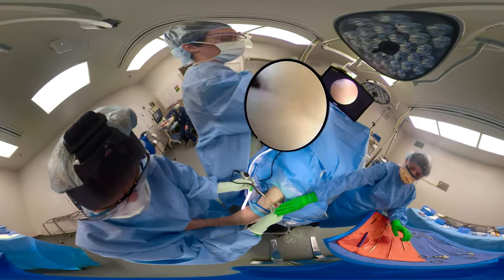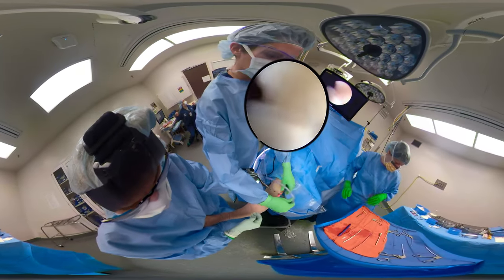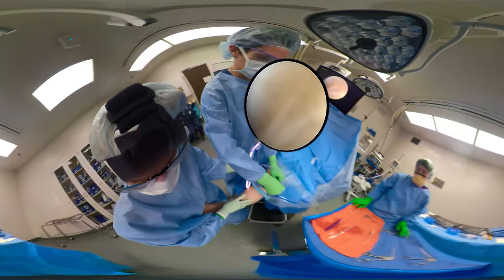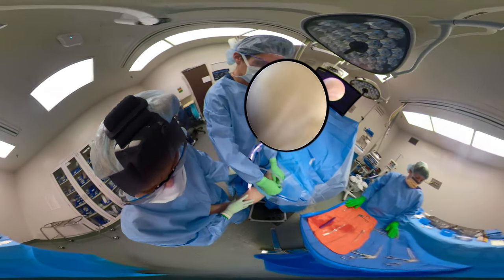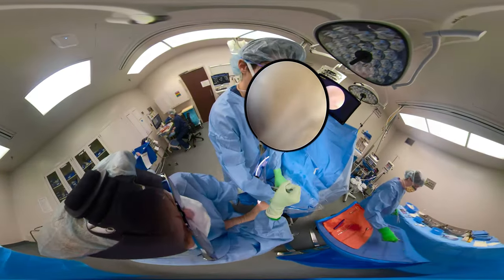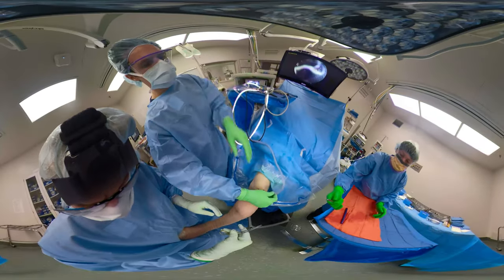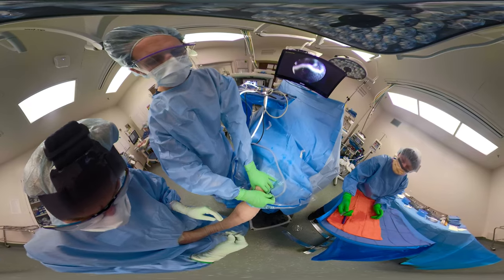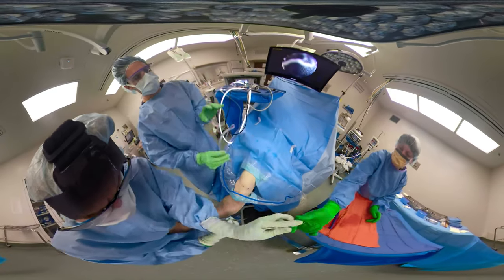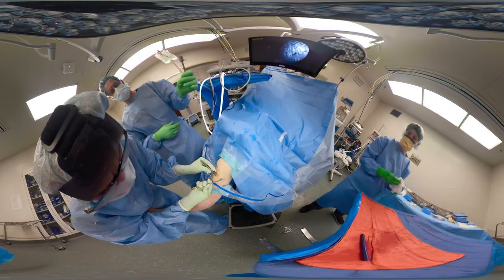At the end of the procedure, you want to use the remainder of your water just to suction out the knee. Maybe you have some fragments still in there from your meniscal shavings. Put the sucker directly on that large metal cannula and suction. Now we will close our portals with a nylon suture, mattress fashion, to reduce any leakage of fluid and blood — because you'll get called in the middle of the night.